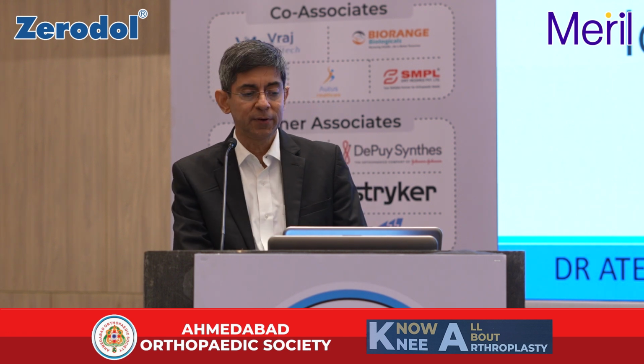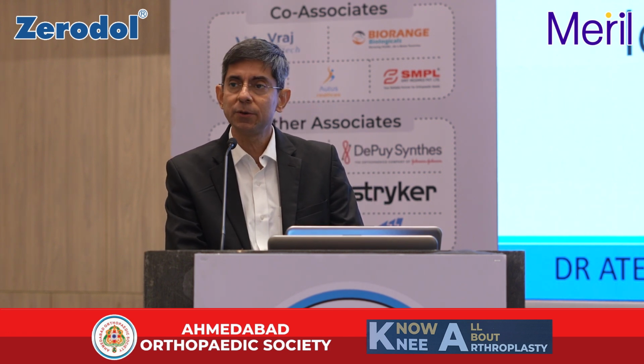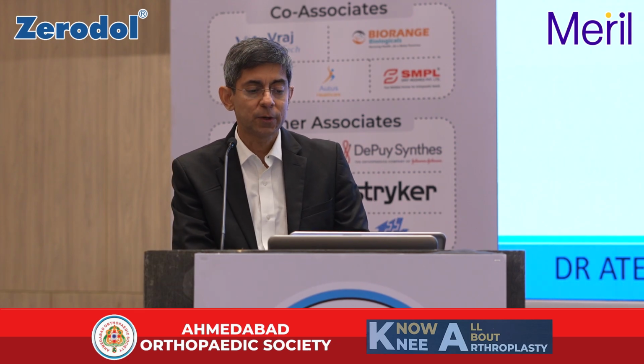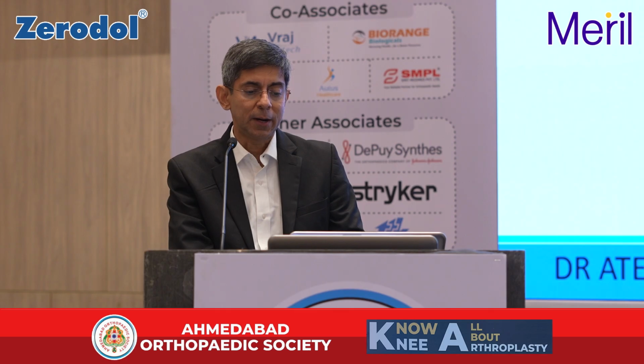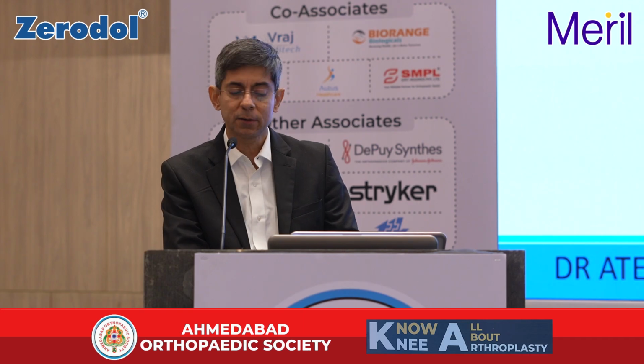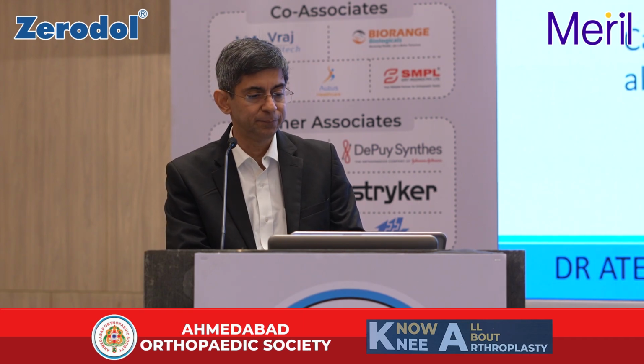But the exact definition is a macrophage-induced inflammatory response that results in bone loss and implant loosening in absence of infection. So what is the pathophysiology? Particulate debris formation, macrophage-activated osteolysis, prosthesis micromotion, and particulate debris dissemination.